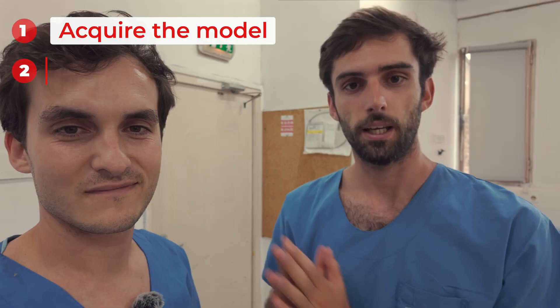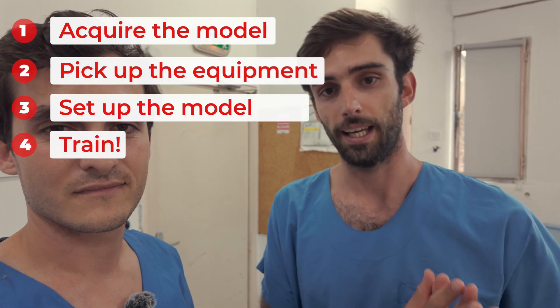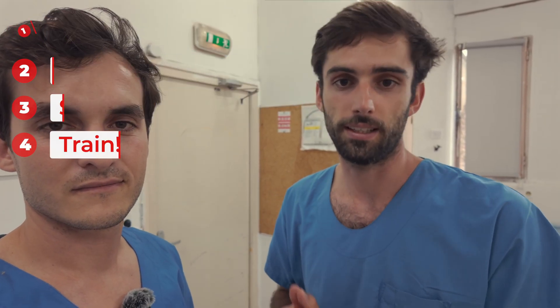Hello everyone and welcome to the lab. To become skilled in submucosal dissection and endoscopy in general, you need to train. With Gene, we're not experts yet but we're training. We've done more than 50 lesions in the lab since the start of our residency, and that's what we're going to show you today. The goal of today's video is to show you how to acquire and then set up your ex vivo models using cow colon — the whole process from A to Z, from obtaining the model to assembling it and setting up practical training sessions.